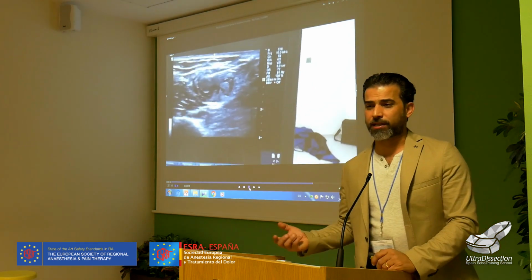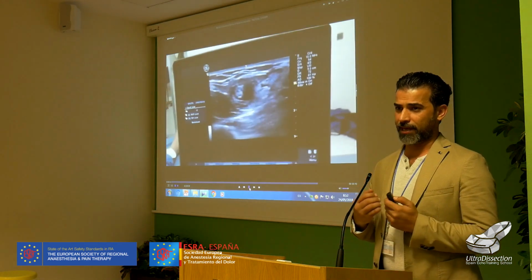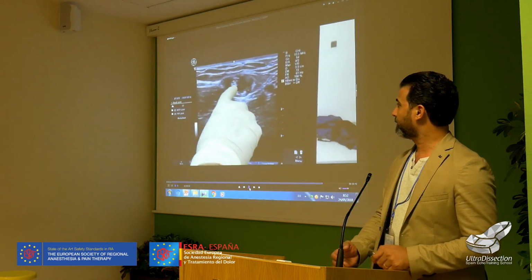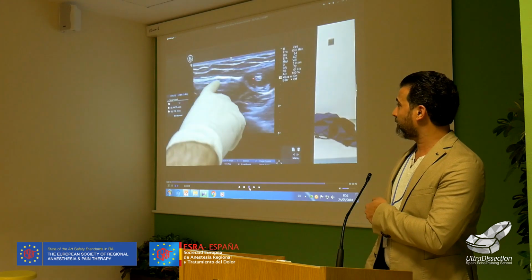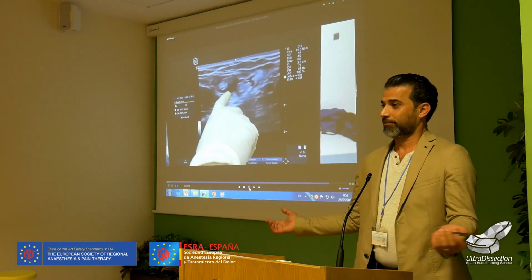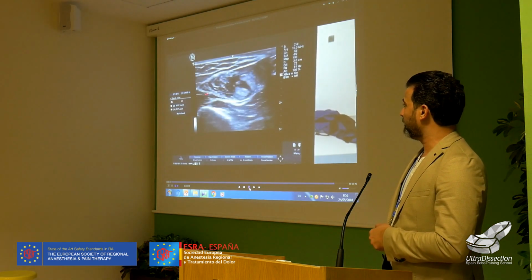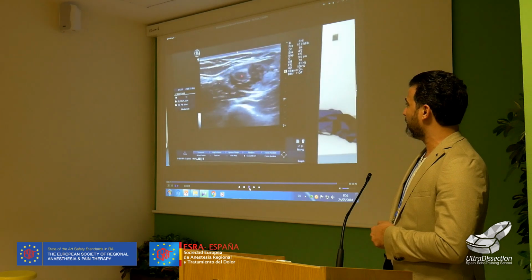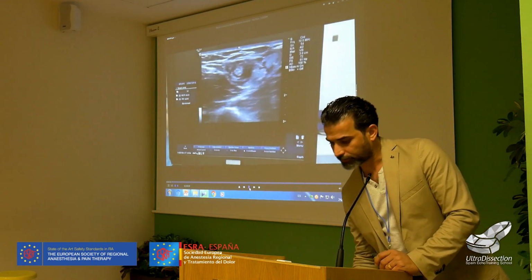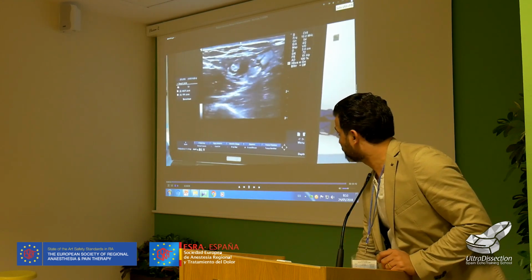This is like a microsurgery. Even in surgery, nobody can dissect the nerve like this, less than 1 millimeter. This is the medial cutaneous of the forearm. See the nerve now appears here, the ulnar, so here the forearm, and the median nerve normal. Now see, decompress the neuroma. See the fibrous tissue here, and now the thickening. I will do radiofrequency here. Now the nerve is very clear. There are a lot of adhesions around it.